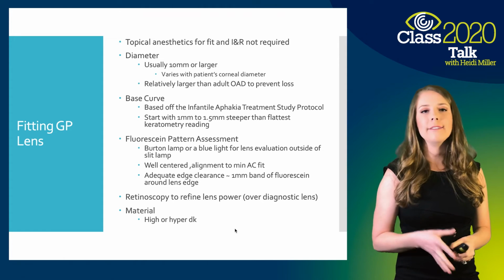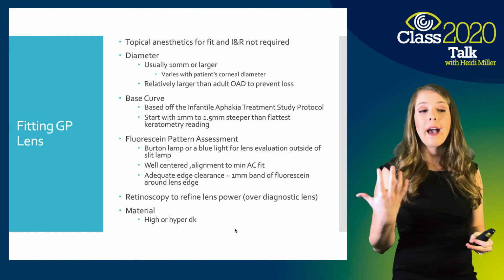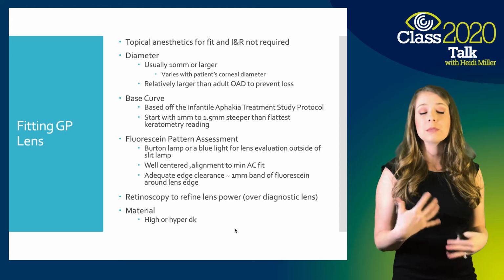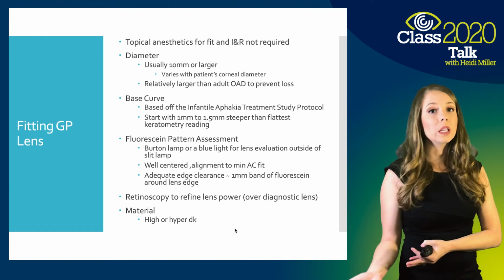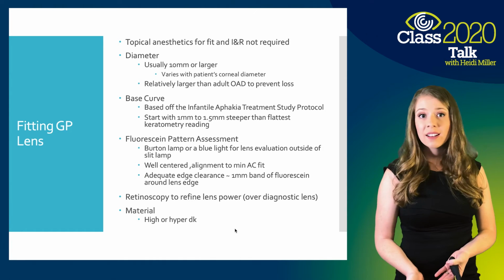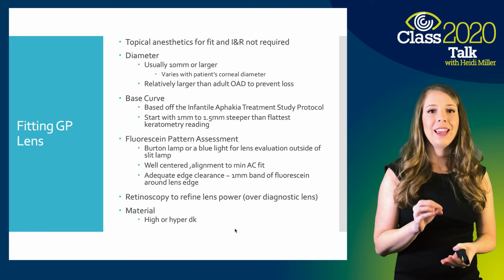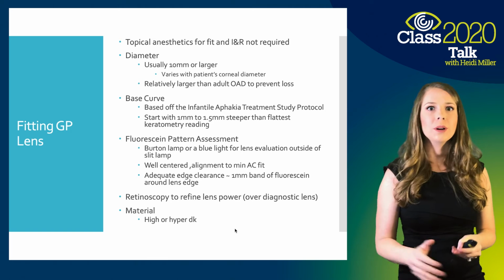But if you have a 3-year-old, 4-year-old, and you think that it's going to help you get better results and help ease the patient, by all means, put that anesthetic in the eye. Oftentimes the patients that I'm getting, especially for aphakia, are infants, and by the time we get to toddler years, they've already gotten really comfortable. But do what works best for you in your practice, and if topical anesthetics helps, by all means do it. But if you think you've only got a 2-minute window to get a lens, fluorescein assessment, and retinoscopy, I would skip the anesthetic and just try to distract and move forward with your OR.